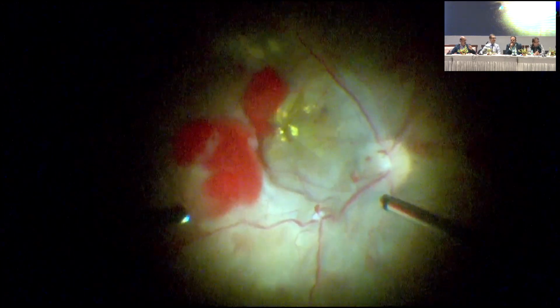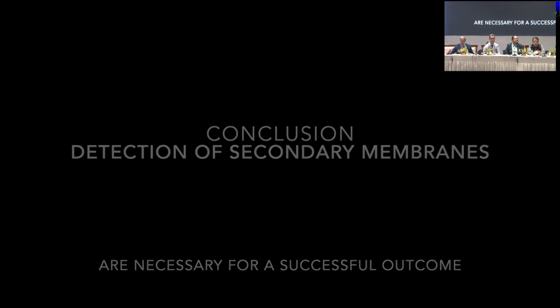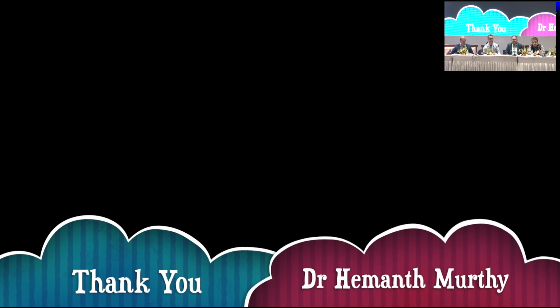Yes, I generally do segment. It's not that one need not remove it all en bloc. We actually divide them. It's a lot easier. Certain times you should not think about en bloc dissection. Certain times it's better to segment so that iatrogenic breaks would not occur. Thank you very much.